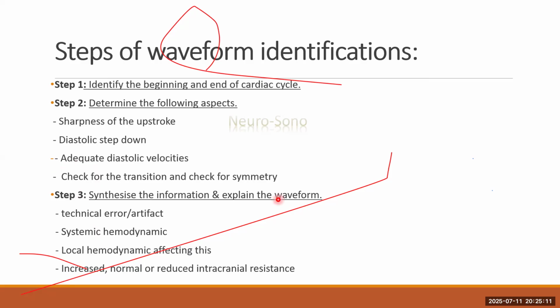And also simultaneously, we need to identify what are the technical errors, whether the waveforms are a reflection of a systemic alteration or a local alteration, or what is the status of the intracranial pressure.